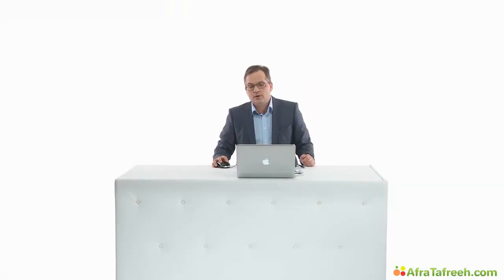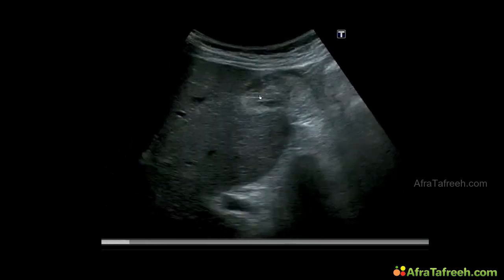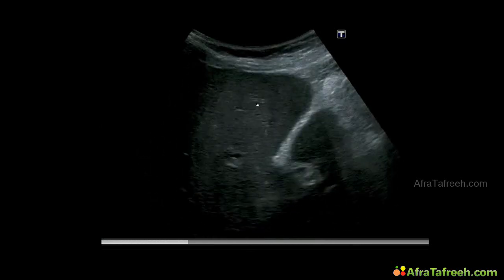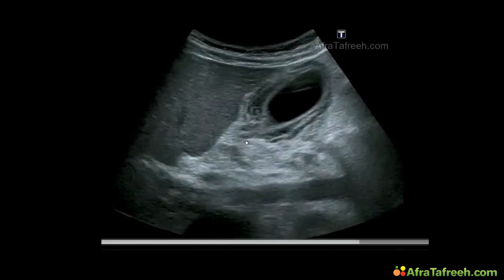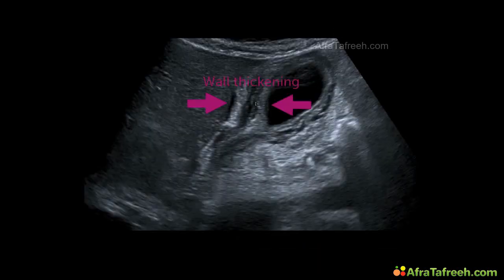Here is an example for a patient without a gallstone, but a very severe inflammation of the gallbladder. We are called to the intensive care unit to perform an ultrasound examination, and you will see there is enormous thickening of the wall. We can see very clearly the layers in between, showing the inflammation, showing the edema of this very severe inflammation. An acute inflammation without a gallstone.